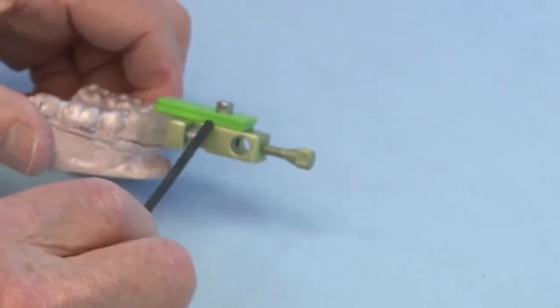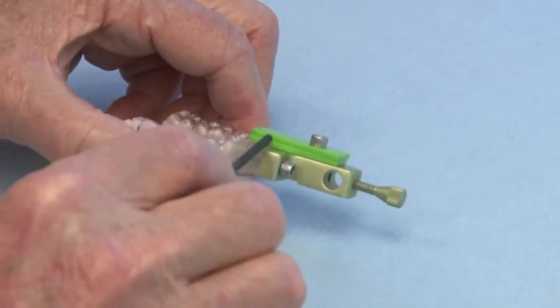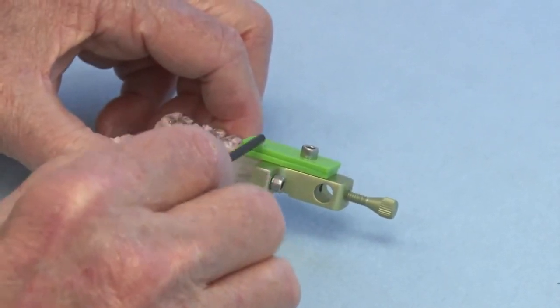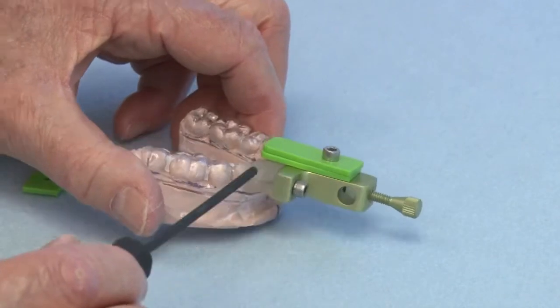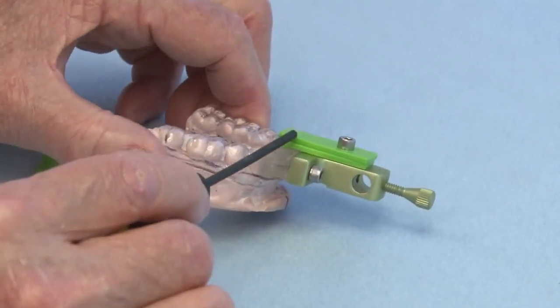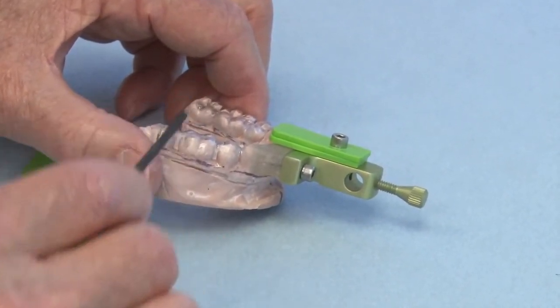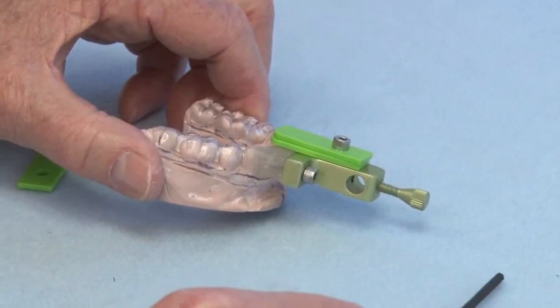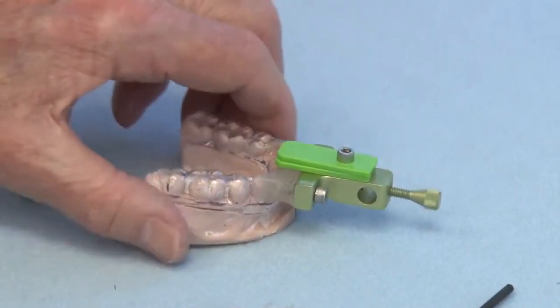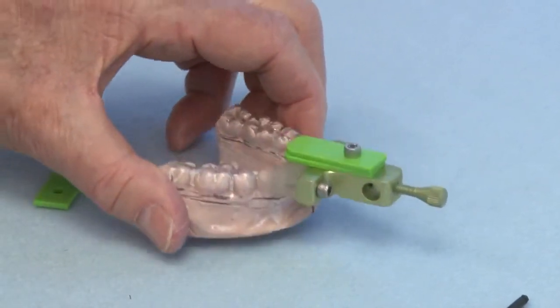These are discluders, and you determine how many of these you need, what kind of thickness you need, so that the patient's anterior teeth would fit here, and as they move side to side, no posterior teeth would touch, and that's the reason it's called a discluder. It discludes the posterior teeth so that they don't touch the clutch when you move. And so this would be the lower clutch assembly ready to put on the patient. Take it off the model, put it on the patient.